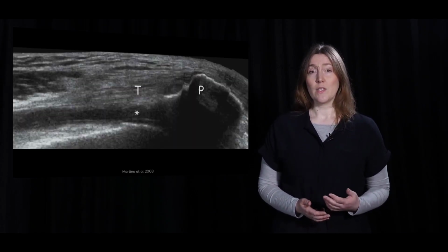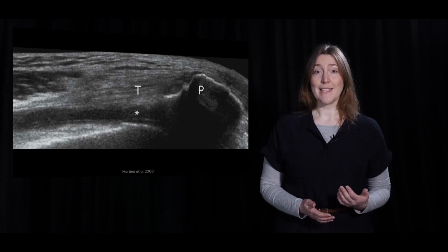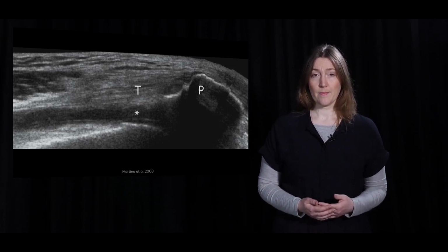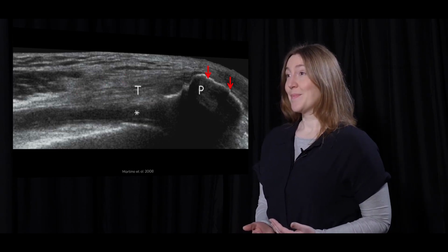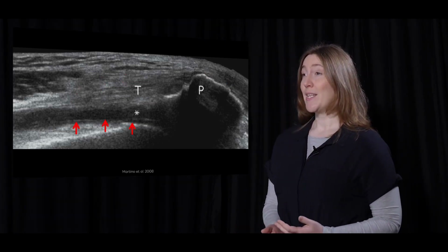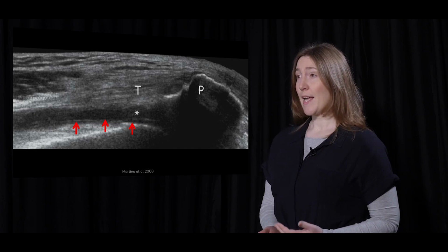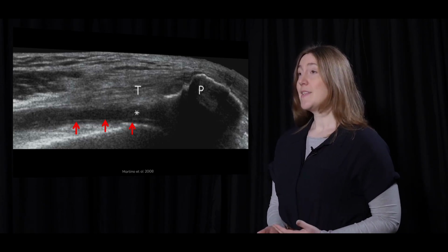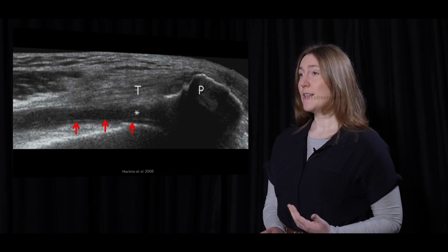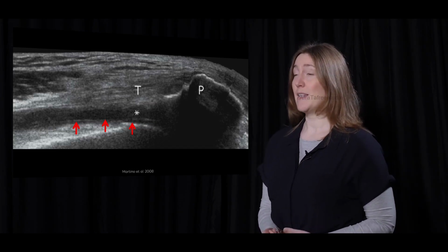This is a longitudinal extended field of view of the anterior compartment of the knee. Please note the quadriceps tendon and the patella. A small amount of fluid in the joint and distension of the suprapatellar capsular recess can be seen due to pathology. In a healthy state, in normal anatomy, this suprapatellar recess can hardly be seen.